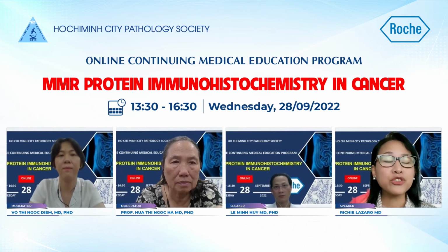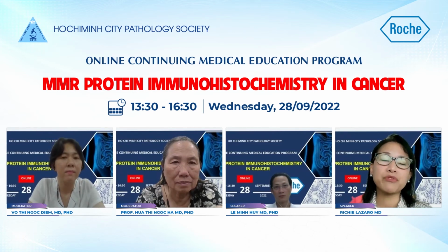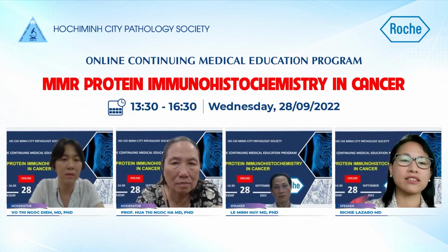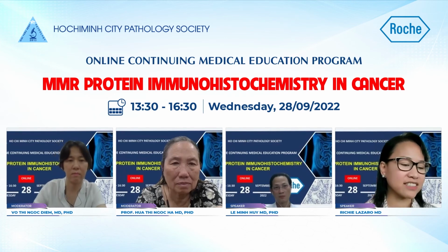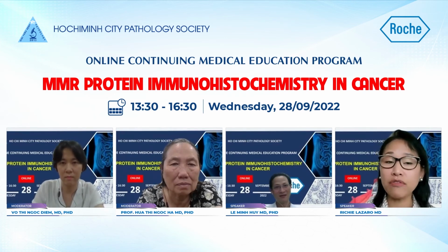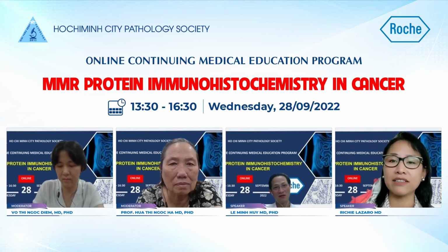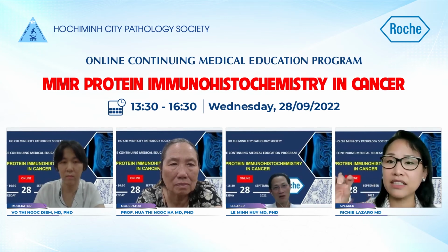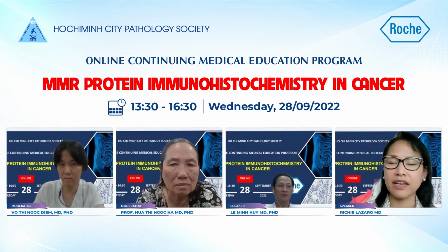In endometrial carcinomas, can we perform 2 markers instead of 4 markers, as in colorectal cancer or not, and which markers are selected? The recommendation is to use all 4 antibodies to complete the MMR panel, because there is a risk of missing an isolated loss of 1 MMR protein.